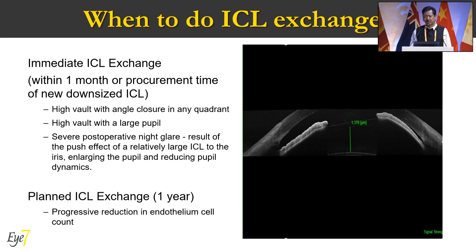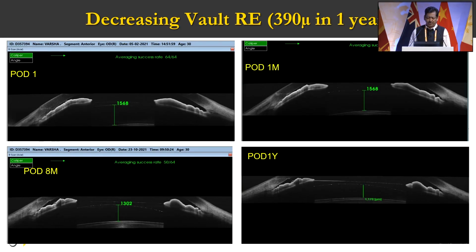And you keep monitoring the endothelium. If you think there's a slight endothelial loss, you can monitor the patient for 1 year and then take your call. Now, why I tell you that even if it is a high vault, you should not be rushing into the ICL exchange. The reason is that the vault comes down with time.